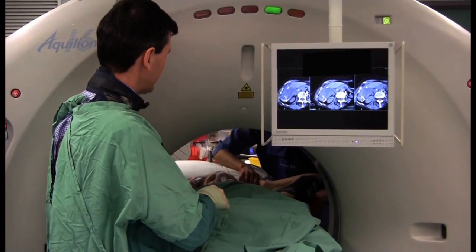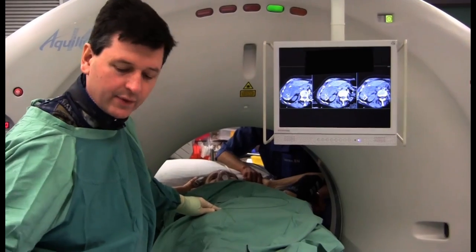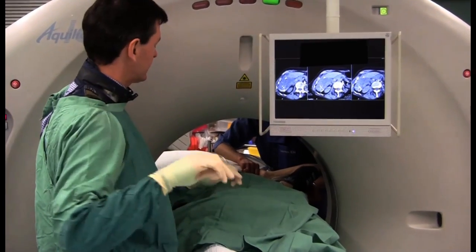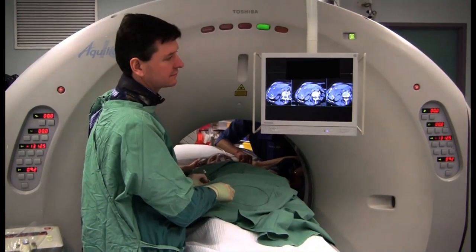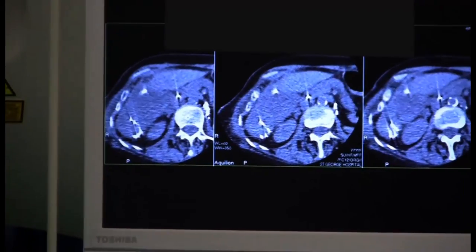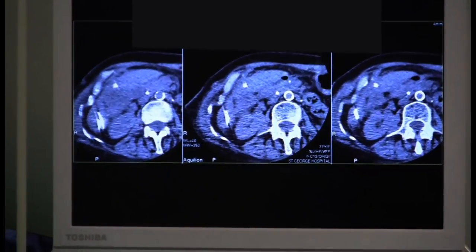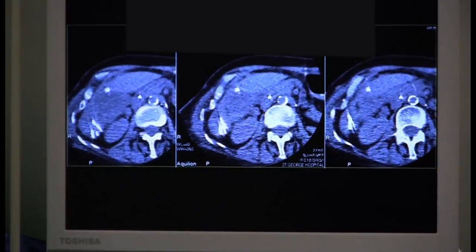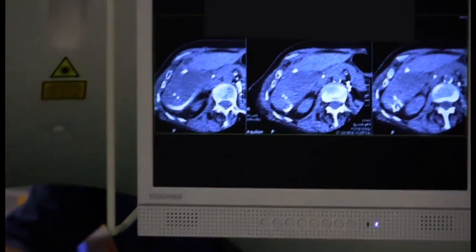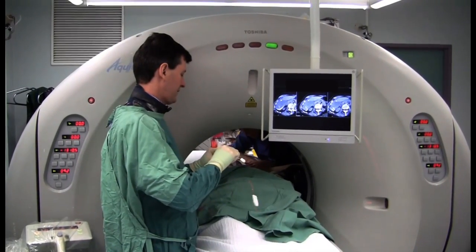Just running a 6-French dilator. Because we watched as the needle tip went in, we know where we are with respect to the anterior abdominal wall structures — quite happy with that trajectory. You can see the dilator there coming in following the guide wire around. Just swapping that out for the 8-French self-retaining drain.